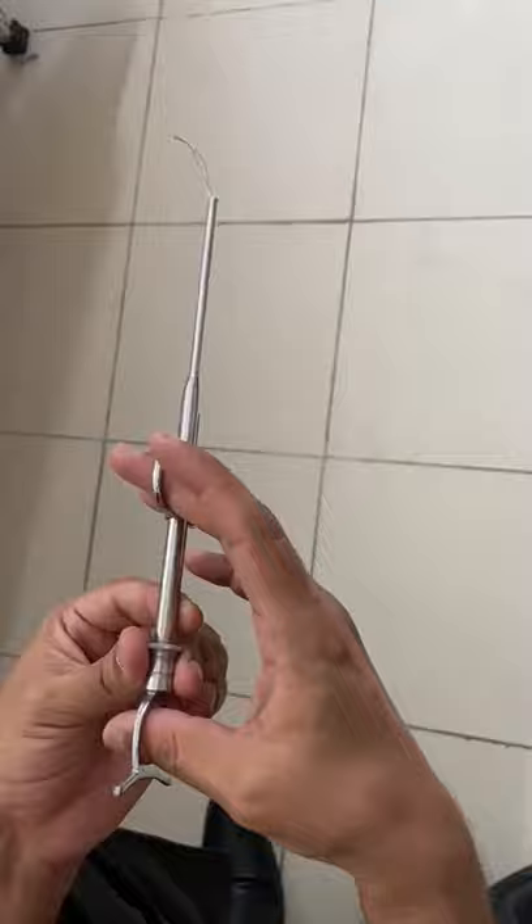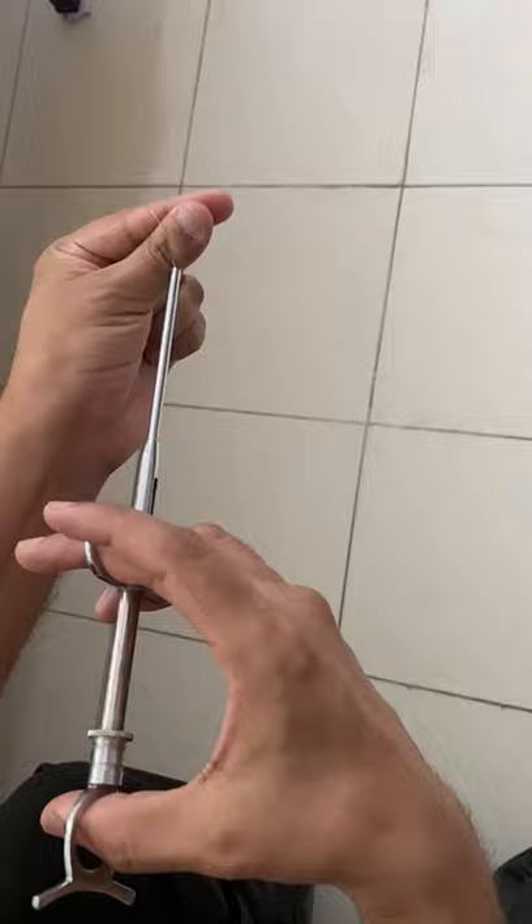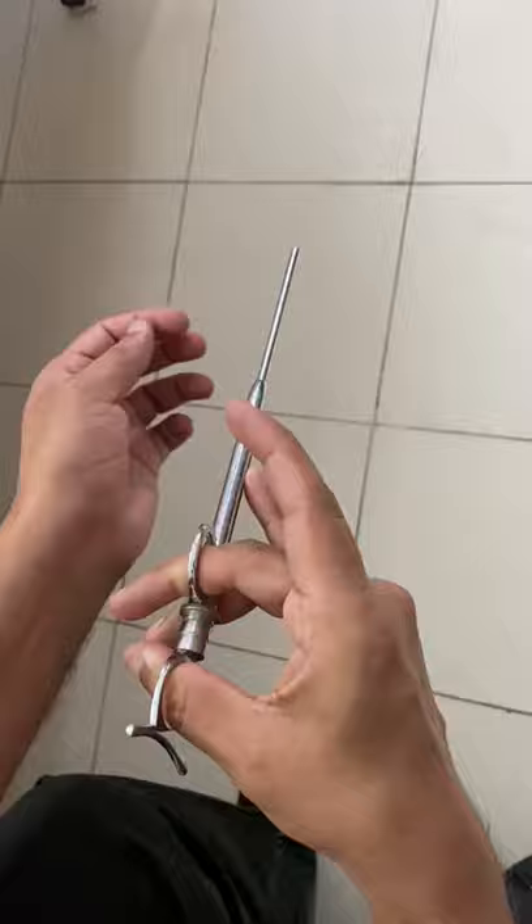It is just like hanging punishment. Once you insert it through the Tonsil completely, you try to pull it like this. Push it like this.